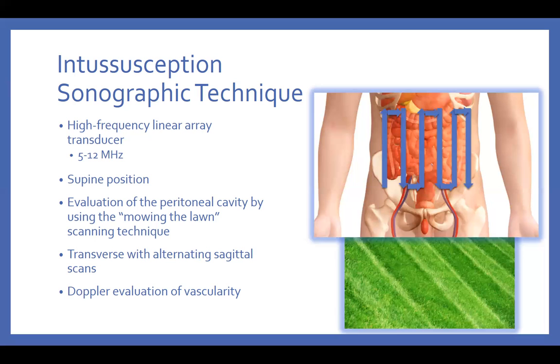Most of those exams are done in a supine position, which will give you a better look at the area and also better posture, because you don't want to be stretching, and you don't want to be hurting your neck, your muscles, your arms, your shoulders. That can even be more comfortable for the patient. What's important for you and me is to get back to that systematic approach.